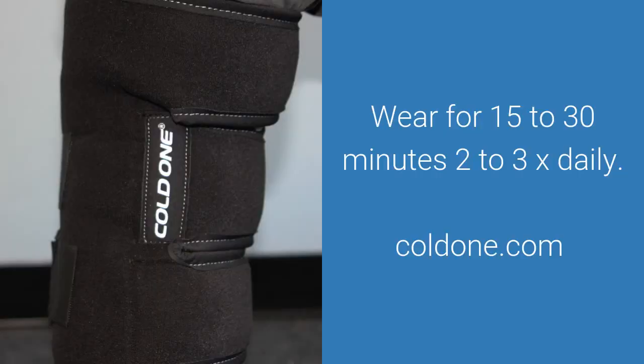Apply your frozen Cold One Knee Wrap two to three times daily for 15 to 30 minutes per session. When applied this way, you'll get maximum effectiveness from icing and compression as recommended by orthopedic MDs for sore and swollen knees.